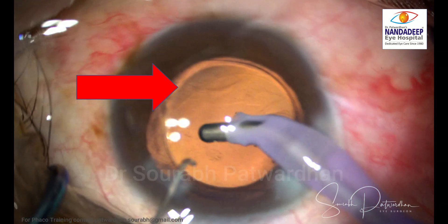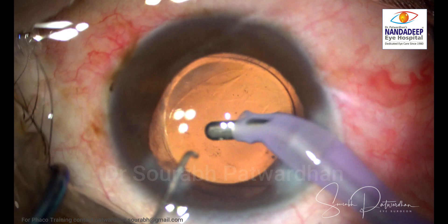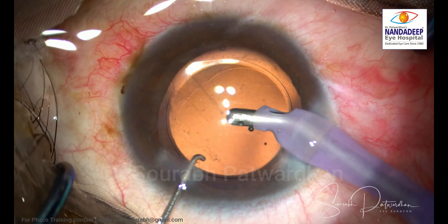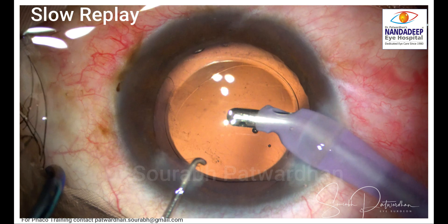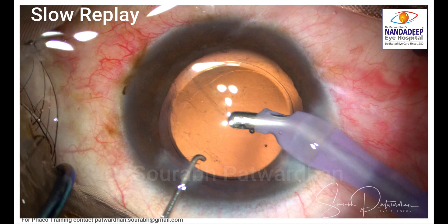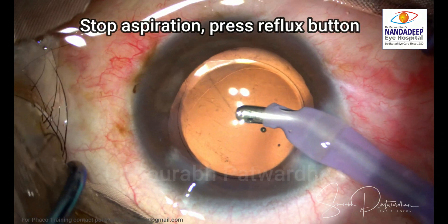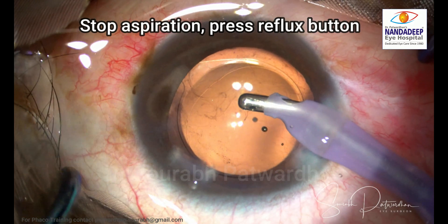Now I am removing the OVD — the Healon Coat that was basically preventing the vitreous from coming out. Once the viscoelastic is removed you can see the fluid is hydrating the vitreous, which first pushed the anterior hyaloid back into the vitreous. But because of the hydration, you can see it came out. The anterior hyaloid or vitreous knuckle just prolapsed out and went into the irrigation-aspiration port — stop the aspiration and press the reflux button at this point, then push viscoelastic into the anterior chamber.